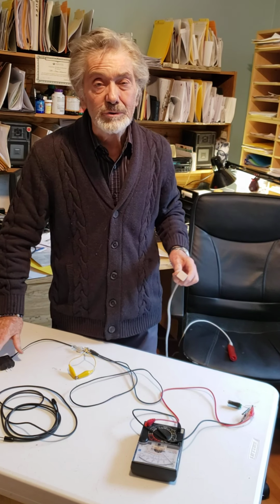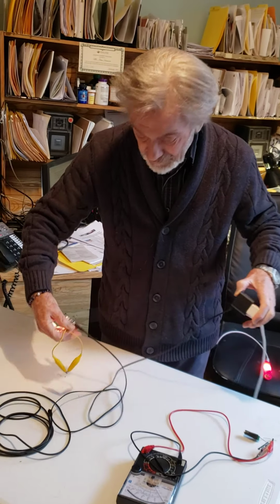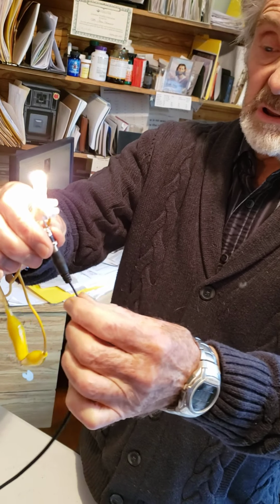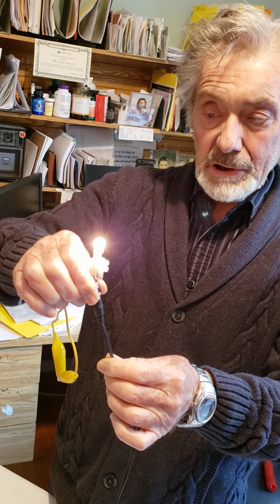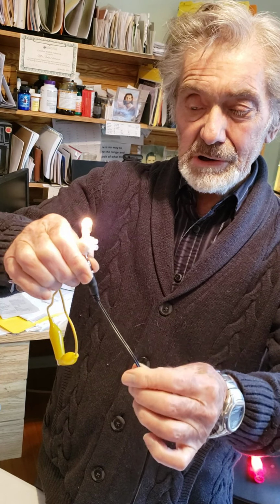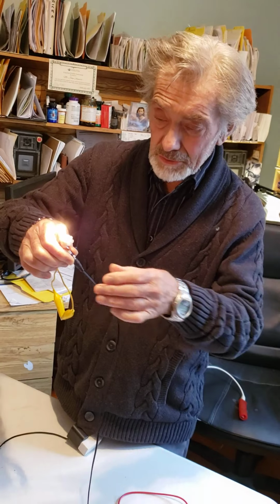Now, I just had a unit returned to me after several attempts at repair. The unit itself was working fine, but when I tested the power supply, this is the power supply, 12 volts, and then when I jiggle the end of the cable, it extinguishes. So there's a broken wire in the part that should be the most reliable, namely the power source. There's a jiggling there, and this little light is showing that it's a 12 volt automobile light, and showing there's a break in the wire, and it makes it look like the instrument itself is faulty, but it's the power that's faulty.